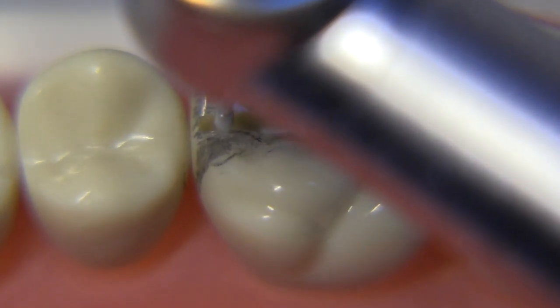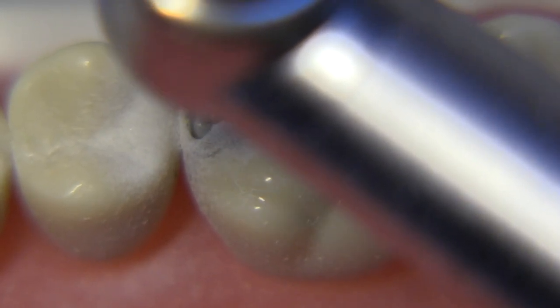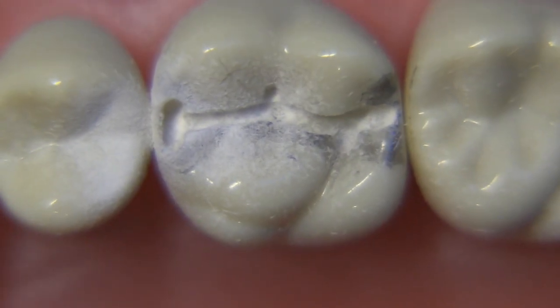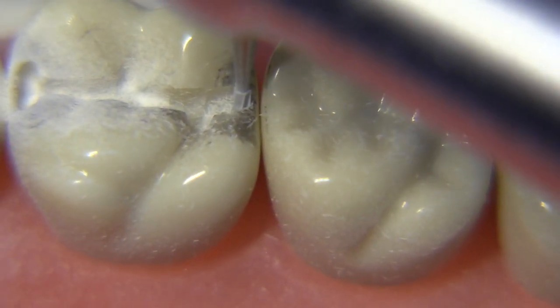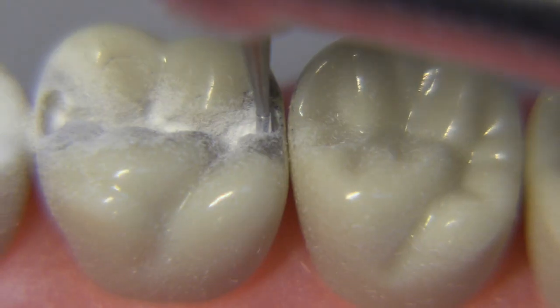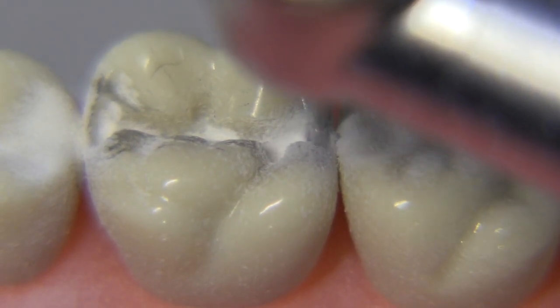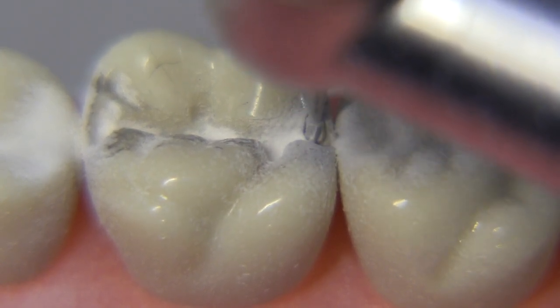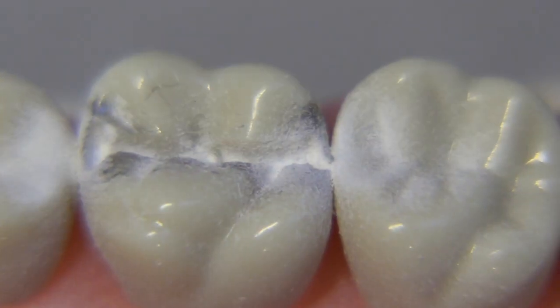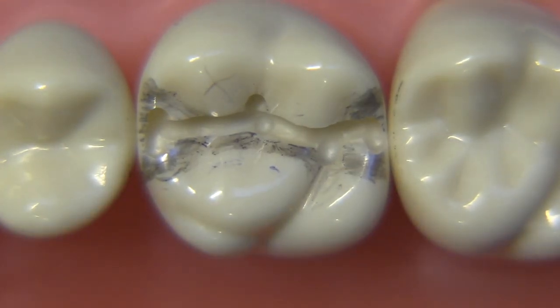I'd like to take the 330 now and just extend the bur a little bit towards the facial-lingual in the box areas — I'm not really shaping anything, just getting the basic starting point for the next bur situated. I don't think it's a good idea to make an S-curve at this point or to extend this area buccal-lingually too much because we really don't know what that outline form is going to look like until we've determined where the boxes end up going. It's always better to get your boxes completed before you go back and develop your S-curves.